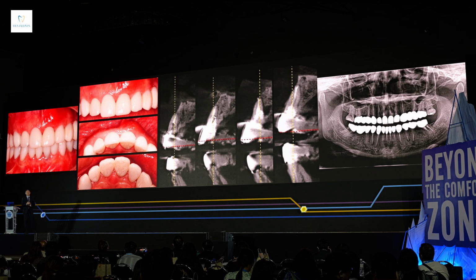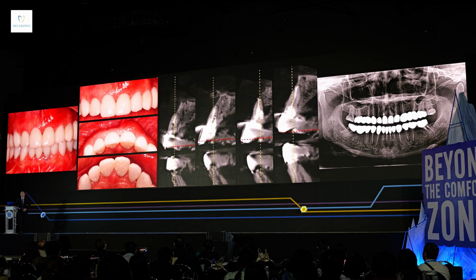So there is some consideration. I'm thinking, if I was not able to place the implant immediately, what should I do? Do socket augmentation or do delayed early? Because it's not possible for the patient to come back based on the time frame of the extraction, right? If I want to do the early protocol, it's not possible for her.